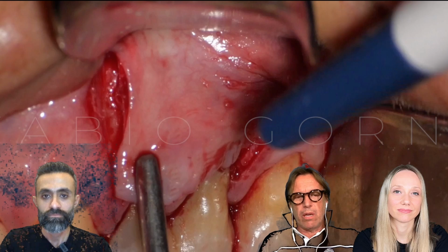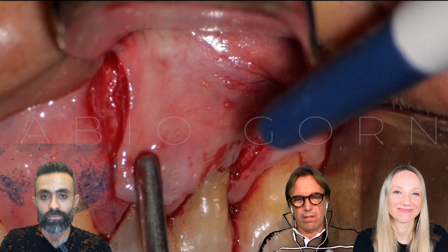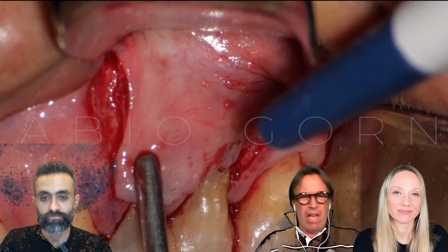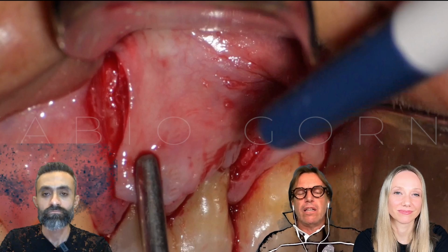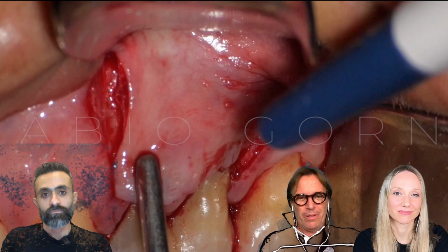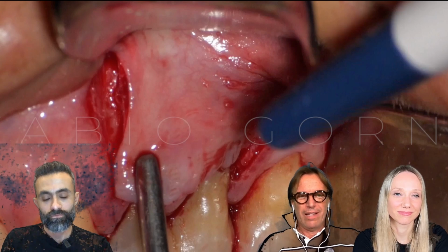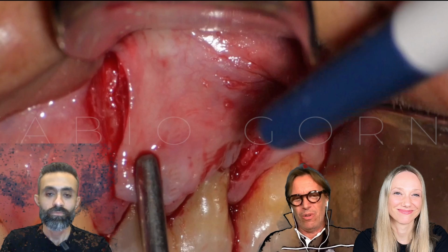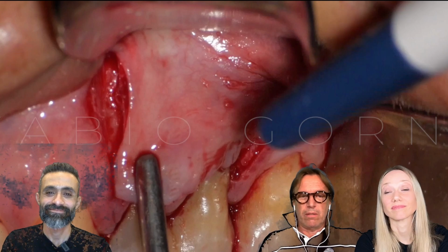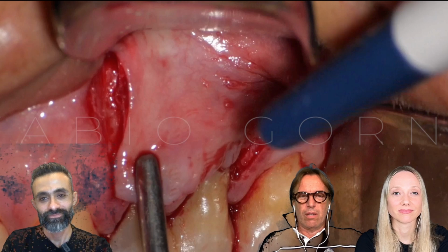But I go crazy when we are discussing the gold standard, talking about MTA or other materials, for example, bevel, no bevel, and you cannot find any evidence in the literature. So why are we discussing something that is not true? Why? Because it's more fashionable? I don't know. Or probably it's more interesting for the commercial part because some brands are more interested in selling bioceramic putty or MTA.